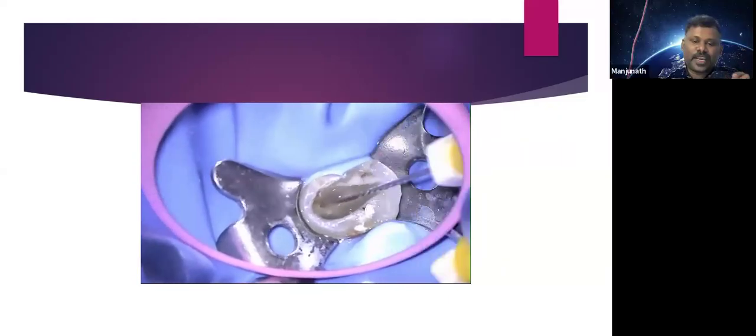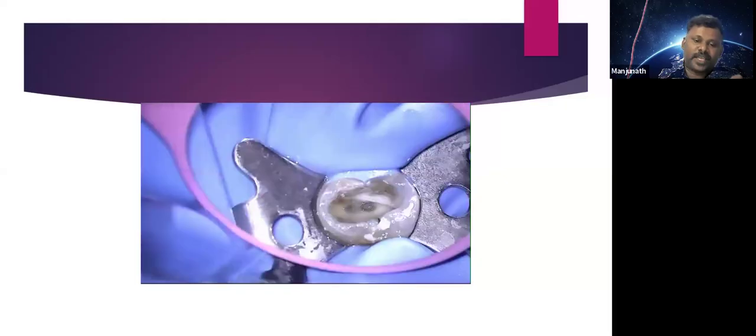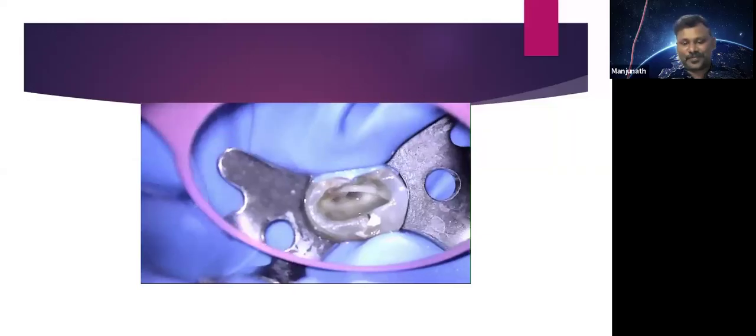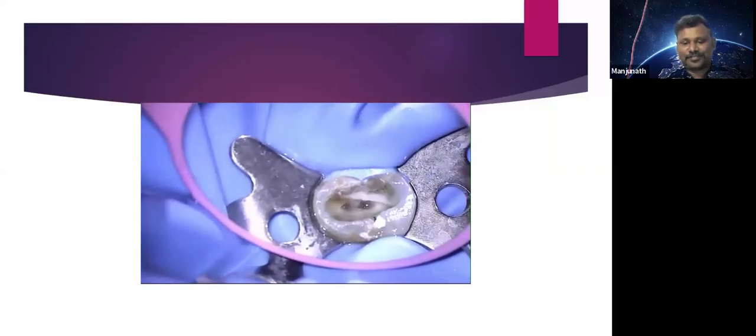And this is another method where I'm using a reciprocating handpiece, where I attach my hand files as a rotary instrument. So I can attach my hand file to a reciprocating handpiece and then activate the irrigation fluid. Again, whenever you are using rotary endodontics, you always have to use irrigation fluid inside the canal. You cannot put a rotary instrument dry inside the canal. You need to put some hypochlorite inside the canal and you have to activate.